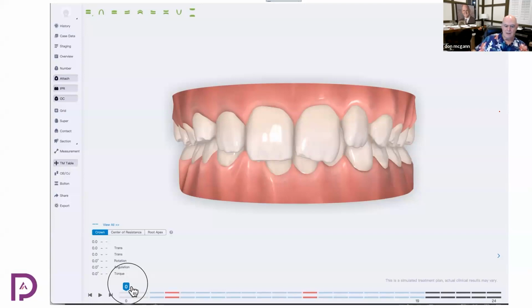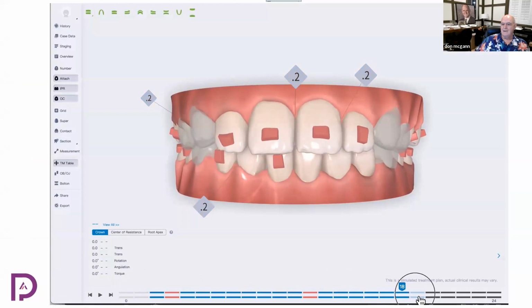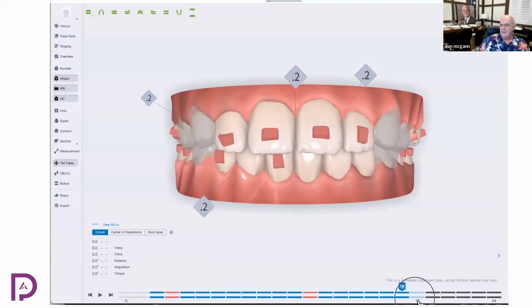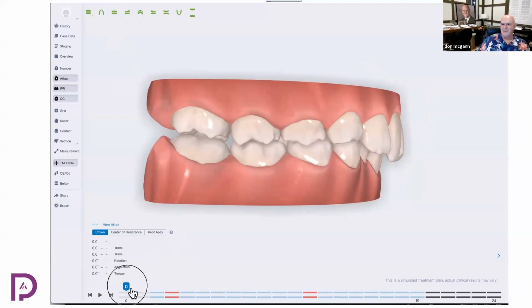Okay, so here's another. We're gonna watch the setup now. Well, here's another way to see a simulation. Do you see the change in the deep bite? You see the intrusion, upper and lower, the incisor advancement, okay? Now, the primary teeth are not substituting in this. That was my big idea. I just had to get that. I said I wouldn't release software without it.